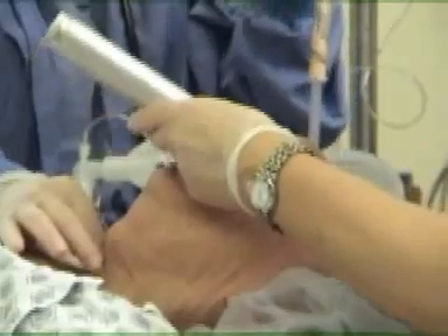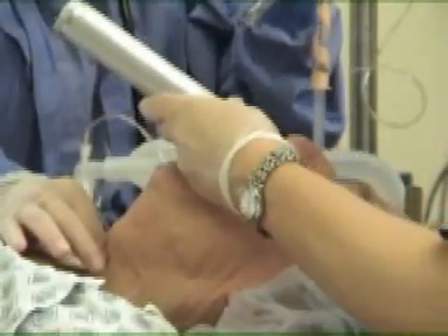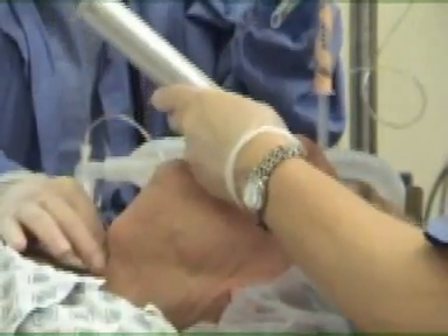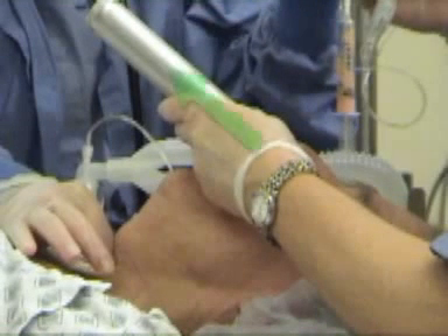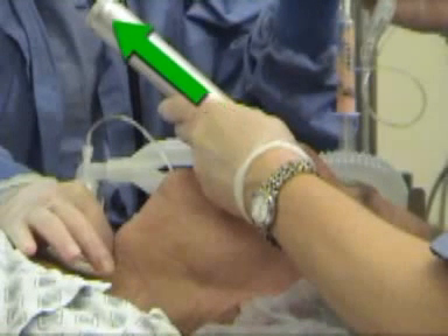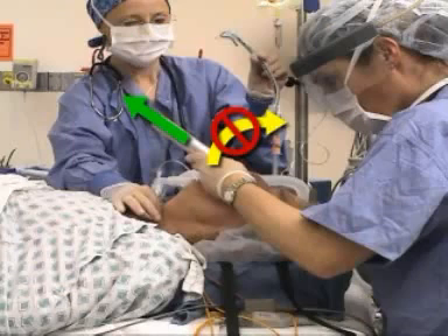When the tip of the blade is correctly positioned, lift the laryngoscope upwards and forwards at a 45-degree angle. Direct the force of your lift along the axis of the laryngoscope handle in the direction of the ceiling over the patient's feet. Avoid bending your wrist or rocking the blade against the patient's teeth, which can result in dental or soft tissue injury and will not enhance the view of the glottis.